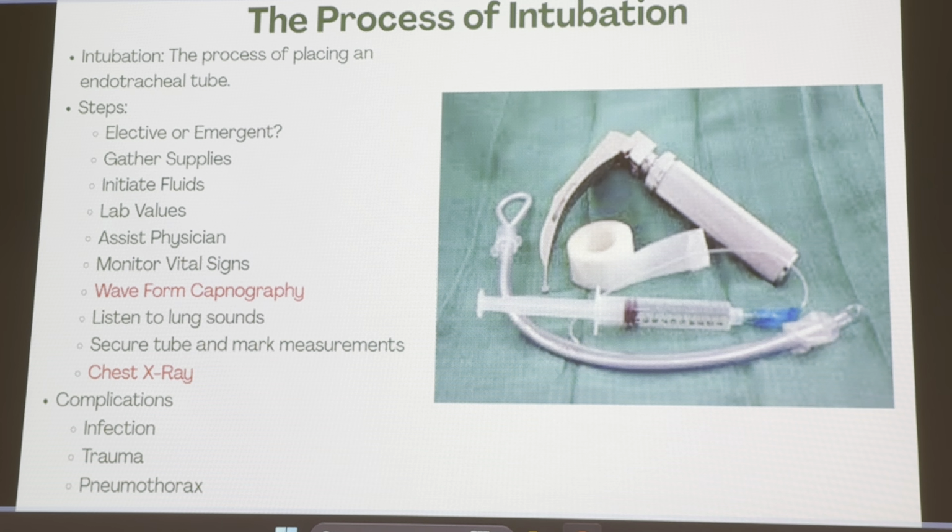And then that's why we're going to get that chest x-ray to make sure we're in the right spot. At that point, when you're pretty much confirmed with waveform capnography and listening to lung sounds, I'm going to go ahead and secure it with one of the tube holders, and you've seen a couple of those, or some tape, something like that. Questions about the process of intubating? It sounds like a lot, but it's a pretty quick process once it gets done.